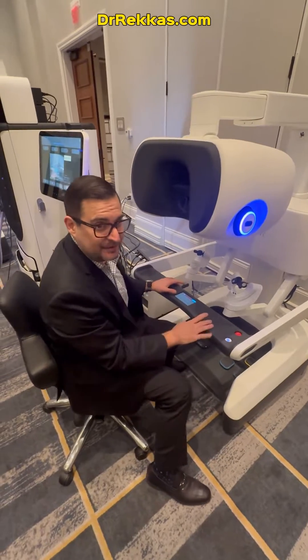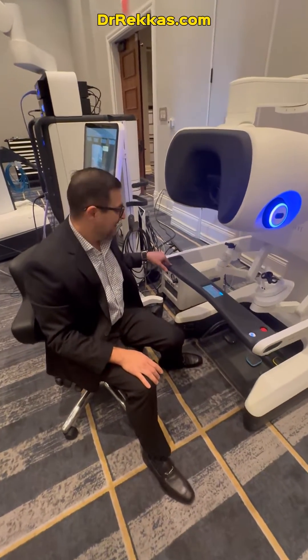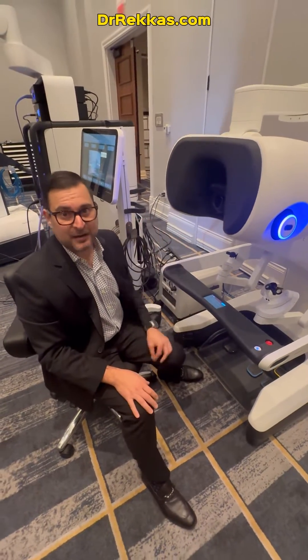Everything's touchscreen. It even has a charger for my iPhone, which is actually pretty amazing. But fundamentally, it's similar but just much, much better.